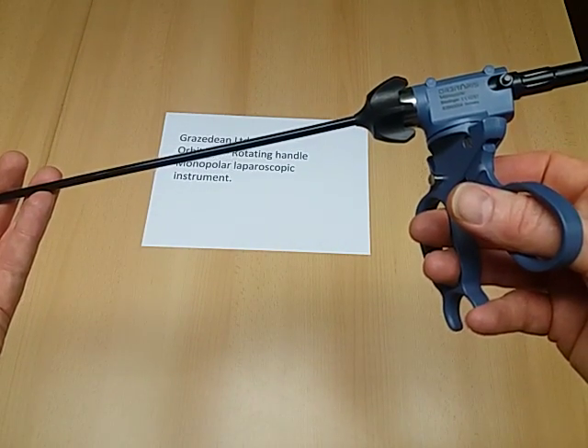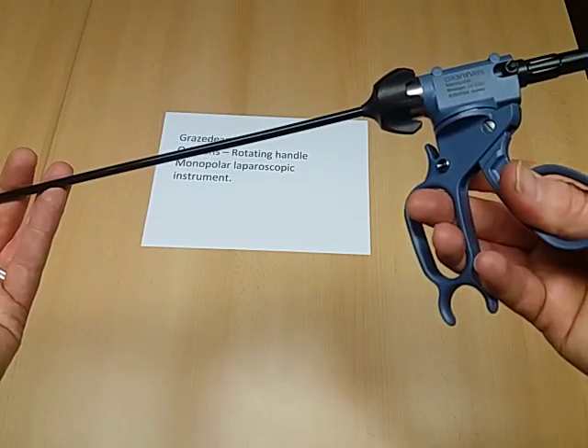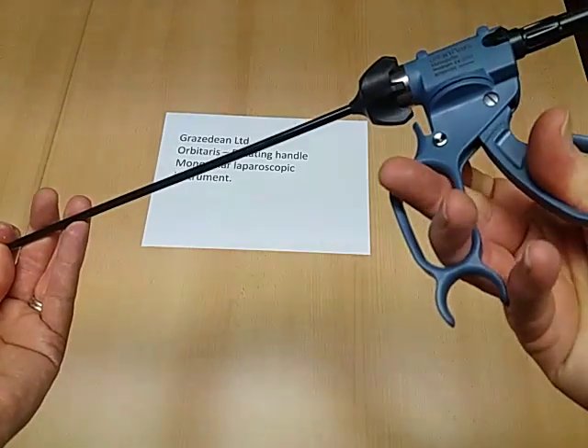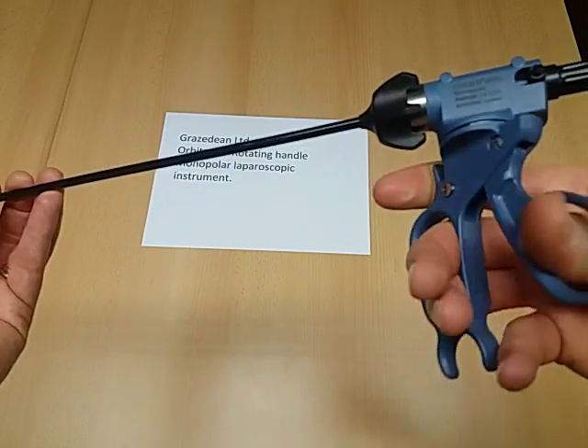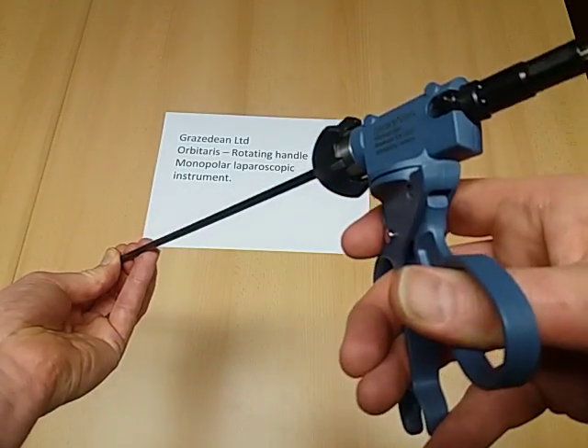It can be locked in any position, freeing up the surgeon's hands to work in the most ergonomic position during surgery.